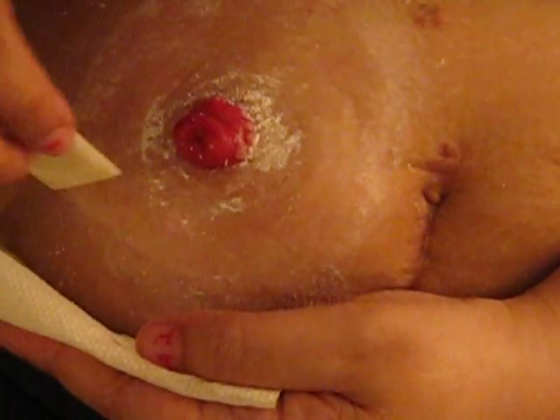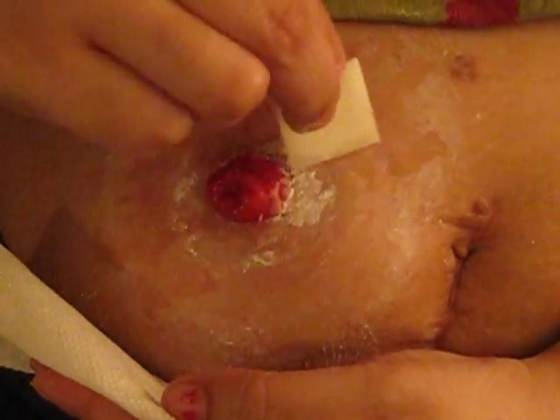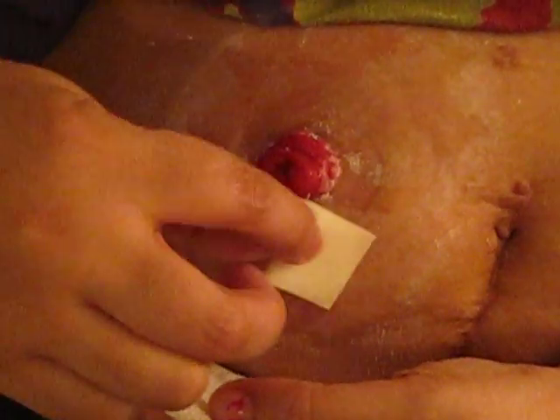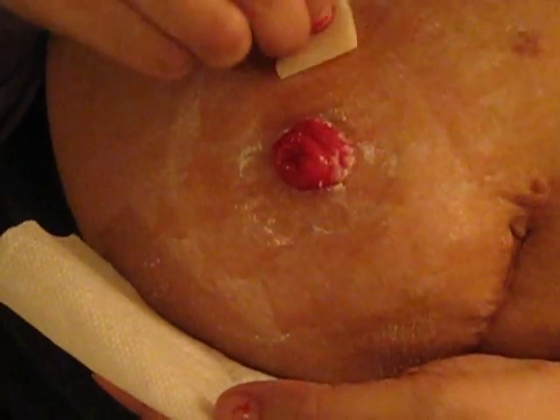All right, so that's all done. Then you open your little sting-free barrier wipe. Whenever it opens up, something is going to come out and you want to pat it down — that way you don't wipe off your powder. So you want to pat all the way around. You can get right up on the stoma; it's not going to hurt it. It's all in the same bag anyway.